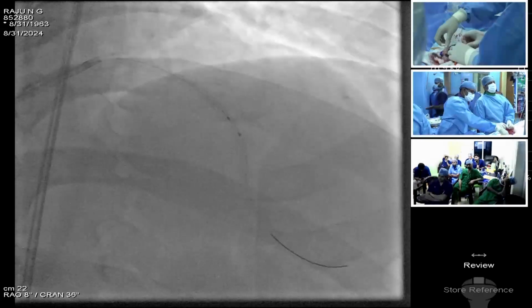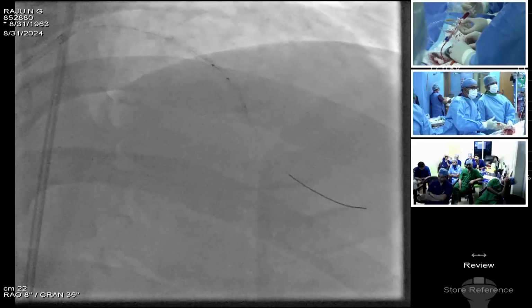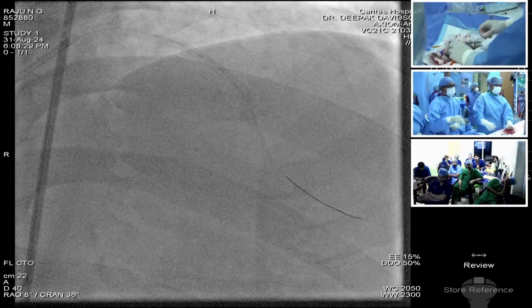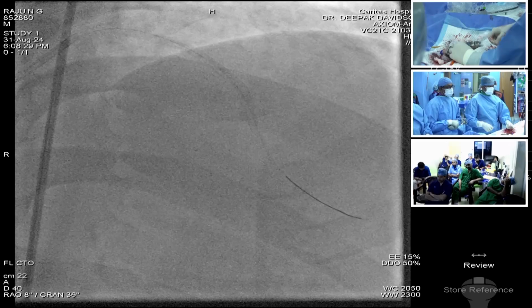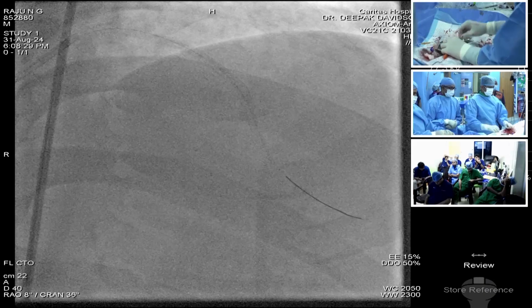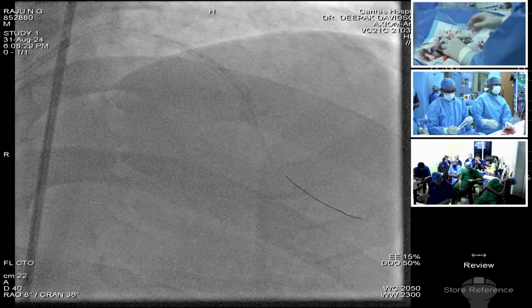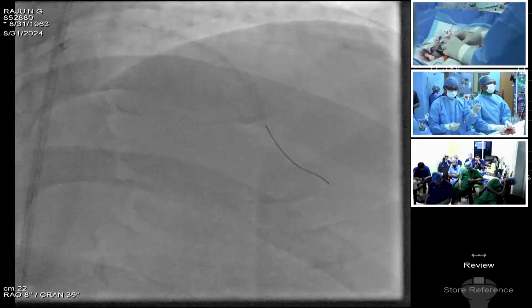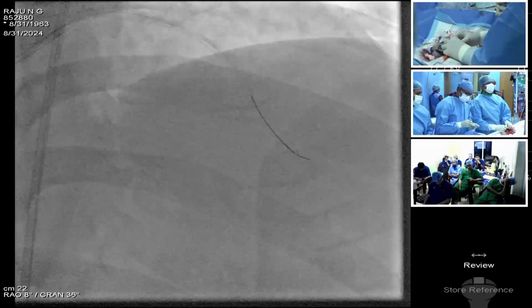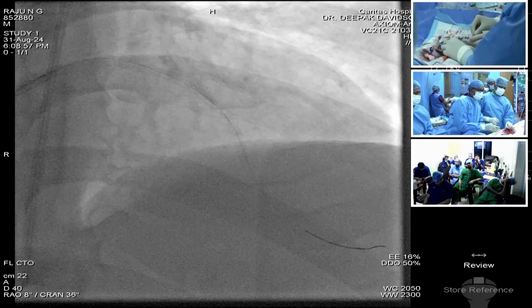Okay. This is 3 into 10. Okay. 18, 20. Negative.